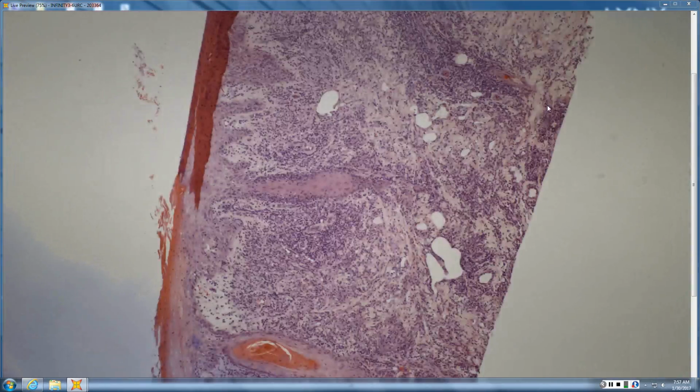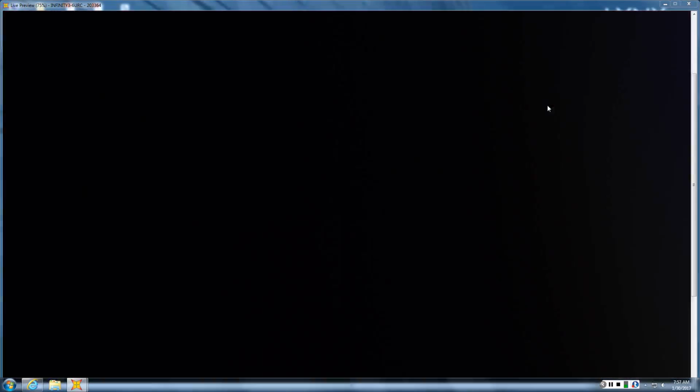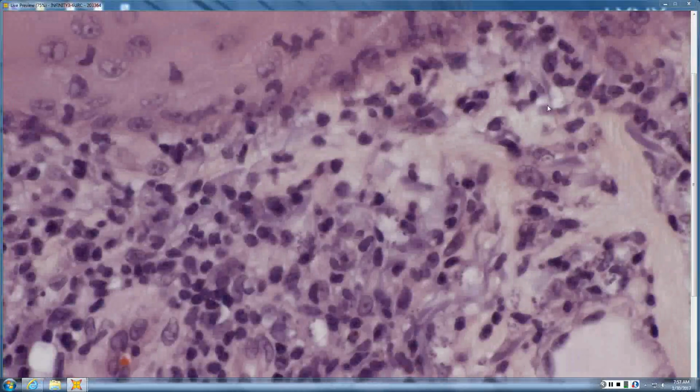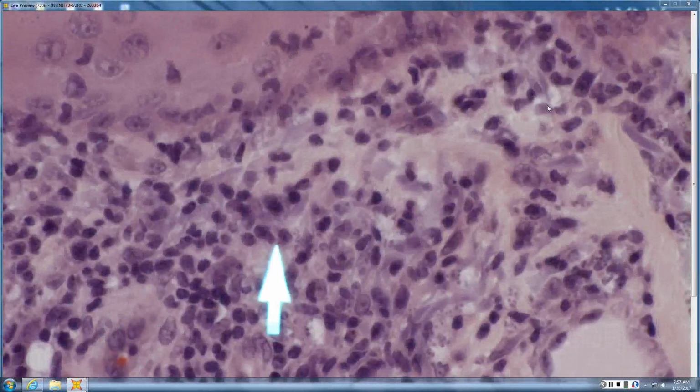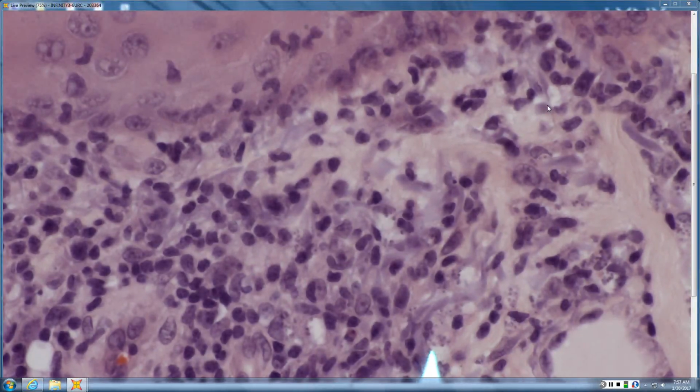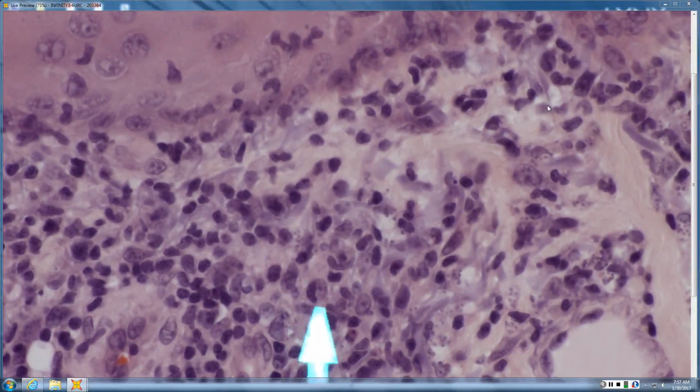So there's the circle sign. The circle sign, so let's look within that circle. I think some lymphohistiocytic infiltrate, but it looks like plasma cells. Oh, and then there's organisms. So that looks like leish. So some are at the periphery of vacuoles and some are clustered, so it looks like leishmaniasis.